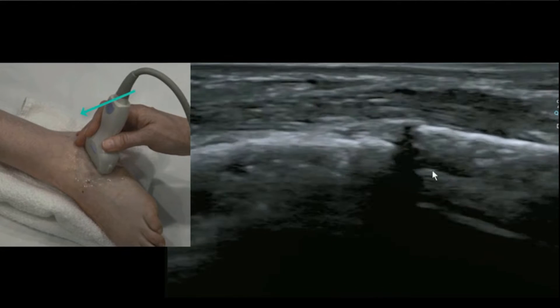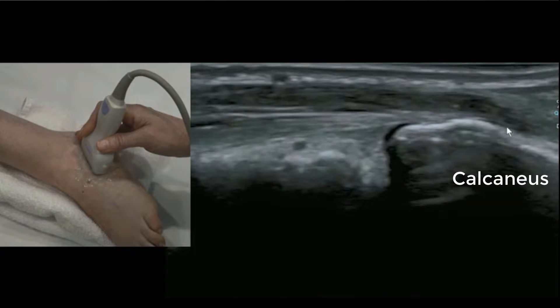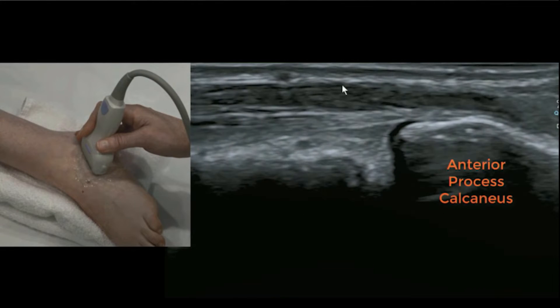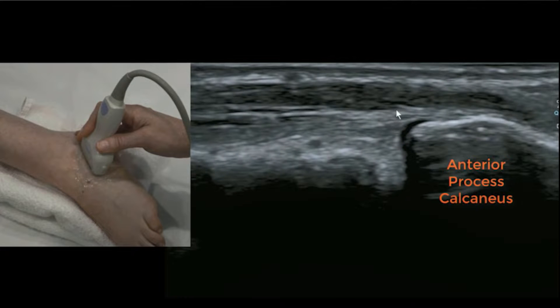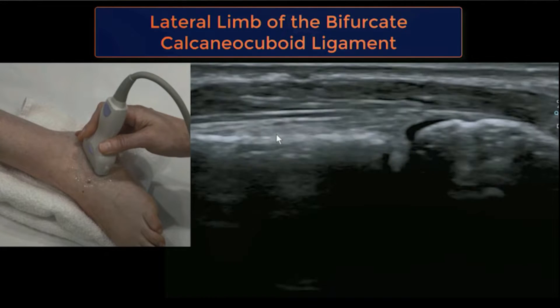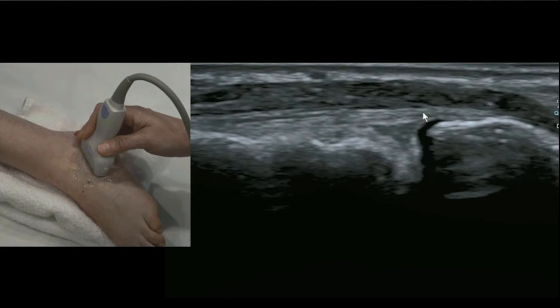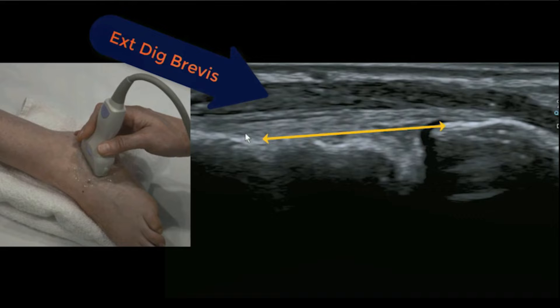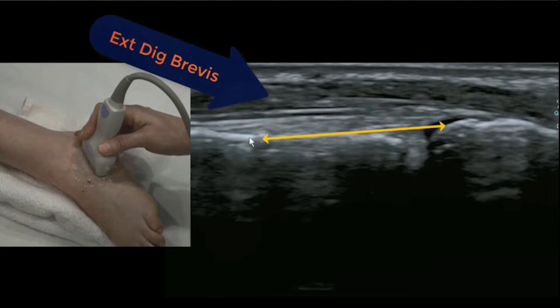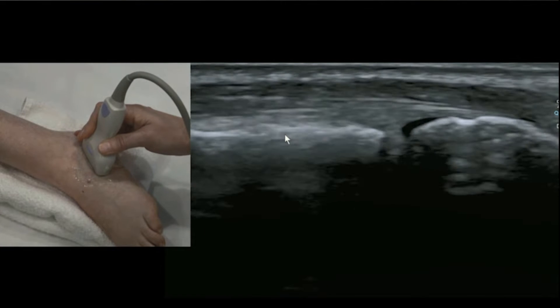That's the starting point for finding the bifurcate ligament. Move up — the bone on the right is the calcaneus, and as it changes shape that's the anterior process of the calcaneus. You'll see a little thin limb, which is the lateral limb of the bifurcate, also called calcaneo-cuboid — we'll just call it the lateral limb. Overlying that you can see the extensor digitorum brevis. Look on the deep side; it's quite a long ligament.